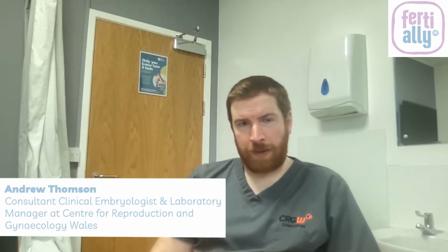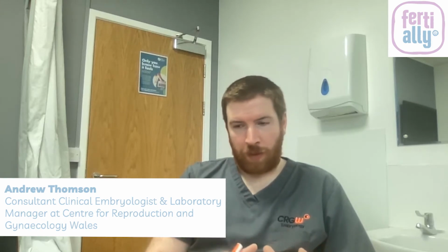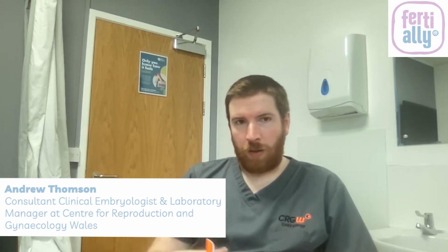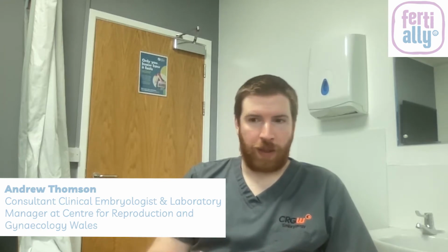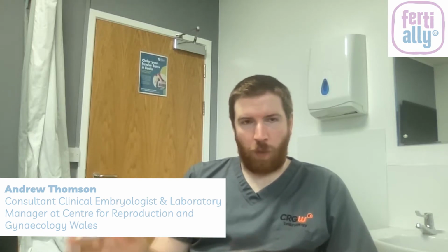Time-lapse technology. Historically, you would have your egg collection, and the eggs would go into an incubator. We'd take them out of the incubator, mix the sperm, check them the next morning, and they'd go back in the incubator. You might check them on day 2, day 3, day 5, and again on day 6. So all you get is little snapshots, and you're having to remove them from their environment to check them.